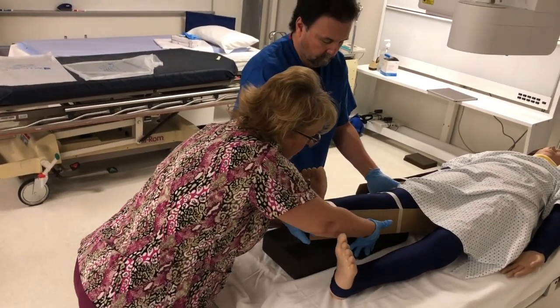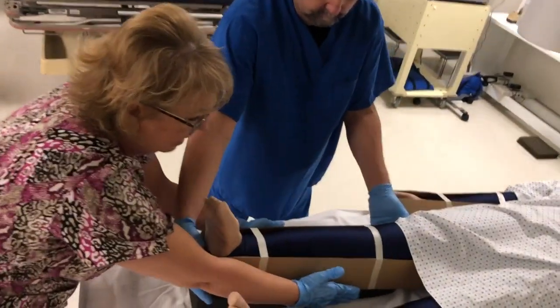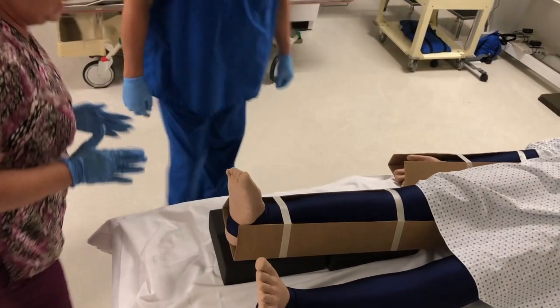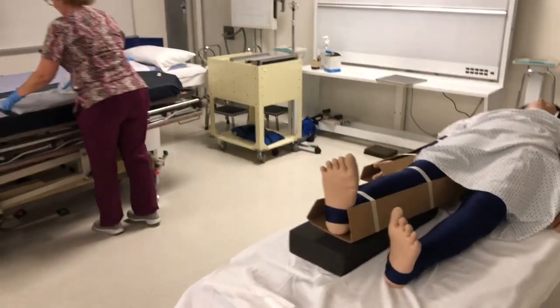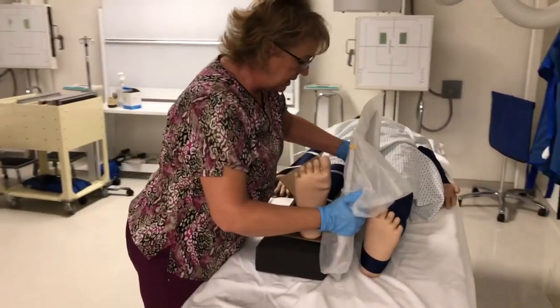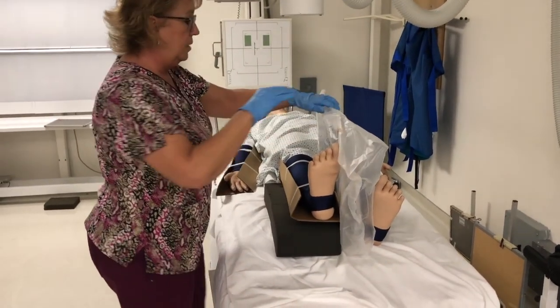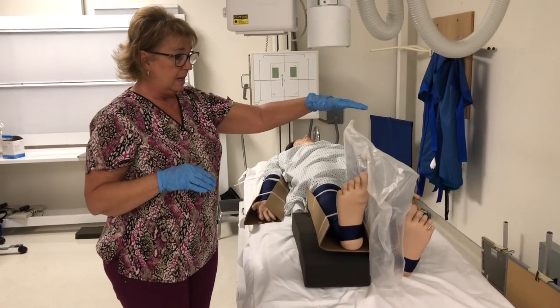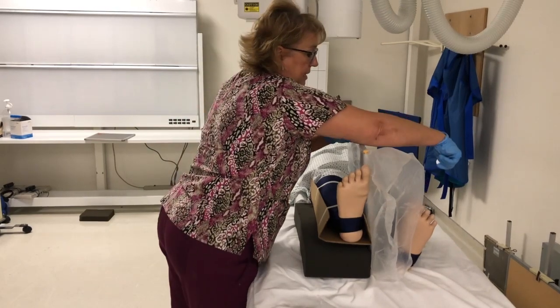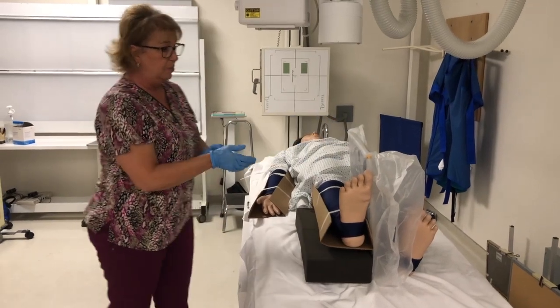Okay, and you want to keep the sponge inside because I'm going to set my cassette here, and I don't want there to be a sponge overlapping. So now the leg is resting. I'm going to take my IR. You can use a cassette holder for this. Typically you're going to see that they don't. What they will commonly do is just set the cassette on edge, and if there's difficulty in balancing it, they'll take some tape from one side of the table to the other just to hold it in place. But this is balancing pretty well.